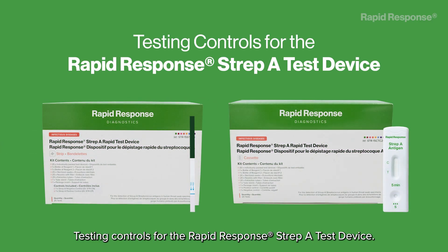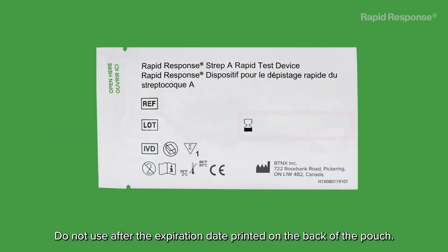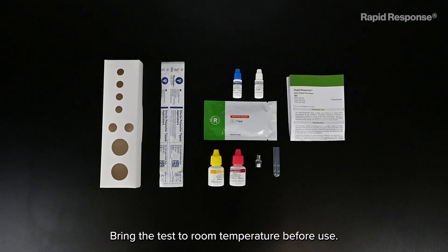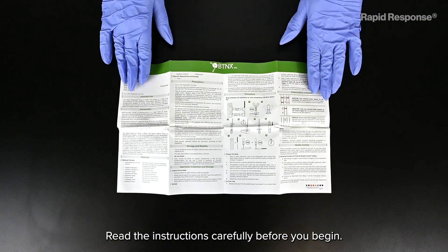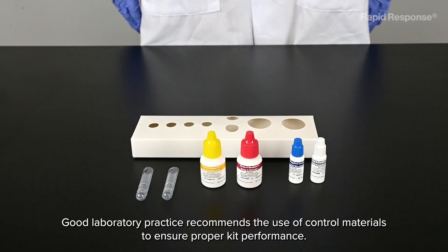Testing controls for the Rapid Response Strep A test device. Humidity and temperature can affect results. Do not use after the expiration date printed on the back of the pouch. Do not use the test if the foil pouch is damaged. Bring the test to room temperature before use and read the instructions carefully before you begin.